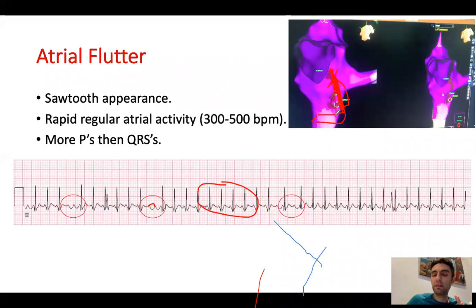You put the anterior pad a little bit leftward but central, and the posterior pad a little bit rightward and central. Don't place them as if you want to cardiovert a VT or a VFib, where you put one at the apex, one at the upper chest. That way you're not hugging the atria. You should hug the atria anterior-posterior. That's the best. That's the least required energy in order to cardiovert atrial flutter. So, anterior-posterior pads.